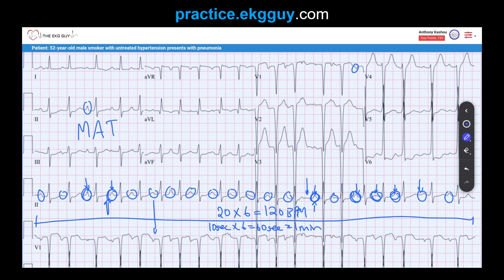The patient's smoking history and presentation with pneumonia favor the diagnosis of MAT, as it is often associated with pulmonary disease. The patient also has untreated hypertension, which may correspond to the large QRS voltages seen in the precordial leads. The precordial QRS complexes and associated ST-T changes suggest left ventricular hypertrophy with secondary repolarization abnormalities.